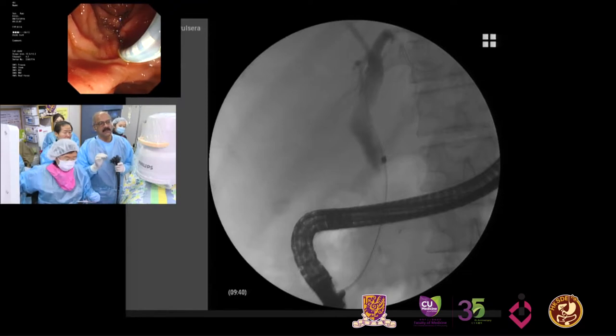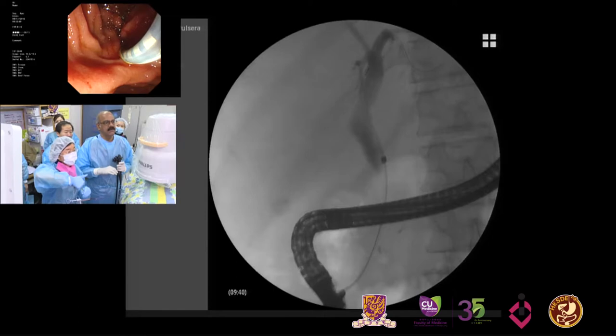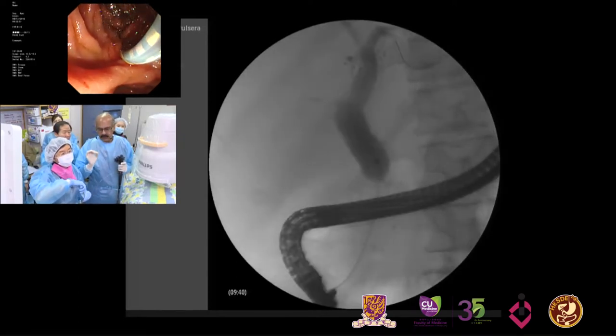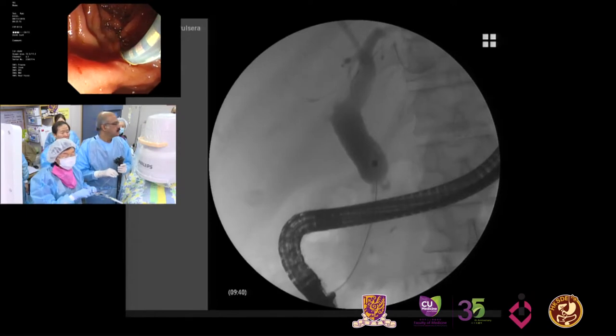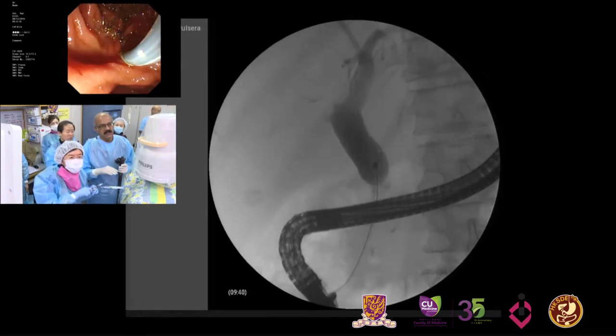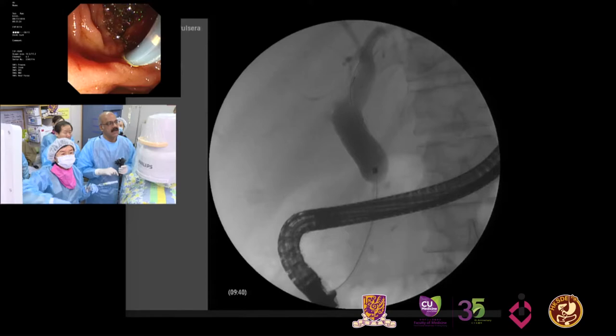Now what I'm going to do is keep the guide wire in place, and measure the length of the stricture before we select the type of RFA. Okay, right, stop. Now you keep pushing the wire. So we'll show you how the stricture length has to be calculated. Now what Esther is doing is pushing the wire inside. You can see the wire going up. So the wire has gone higher up now.